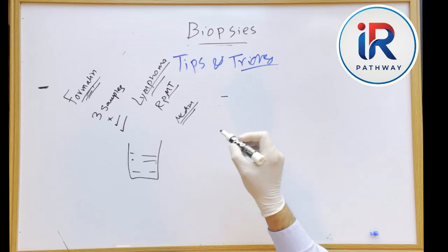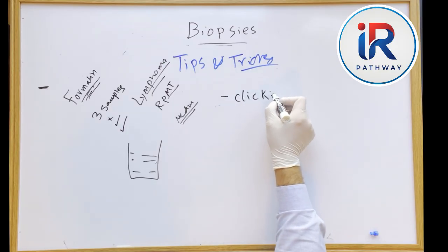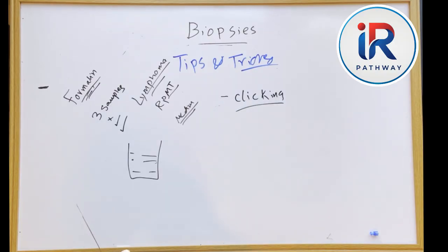Another important point is that these needles operate with a clicking sound, which is very important to note. As physicians, we are familiar with the clicking sound the needle makes, but always remember that the patient does not know this. So, if you are performing, say, a liver biopsy and the patient was not informed beforehand, the sudden clicking sound may startle him, causing unexpected movement that could result in self-injury or procedural complications.